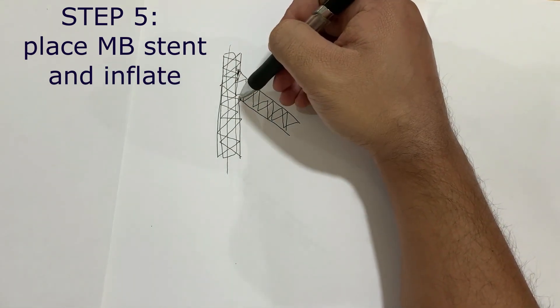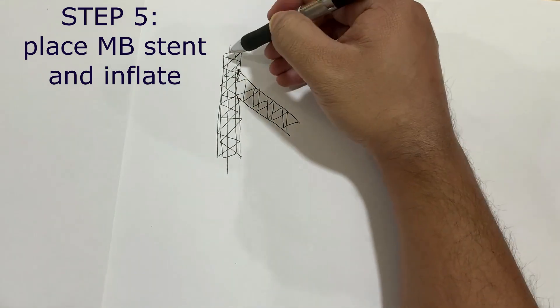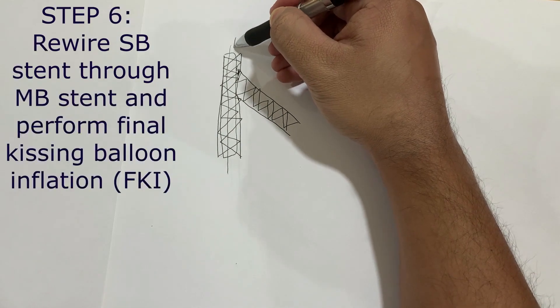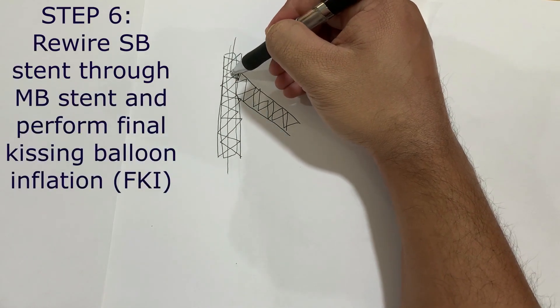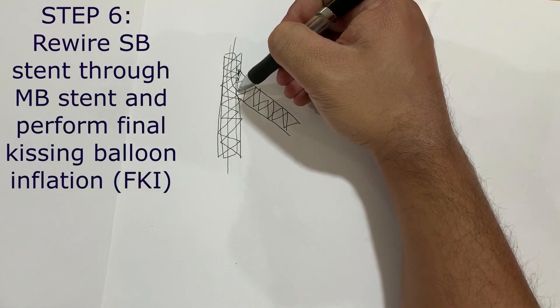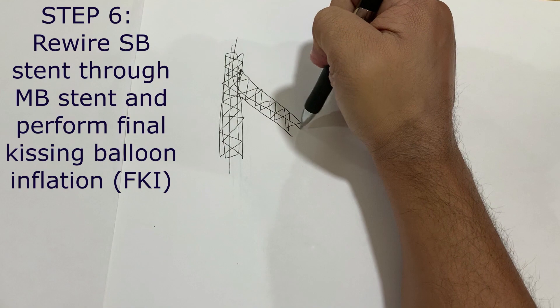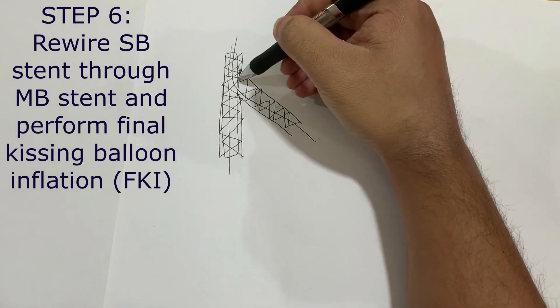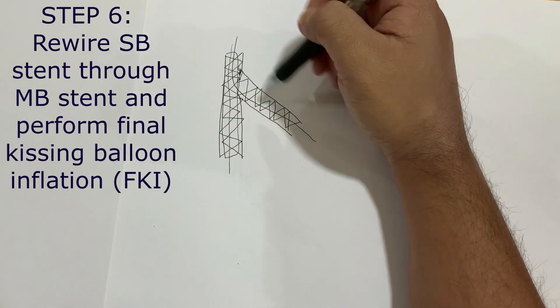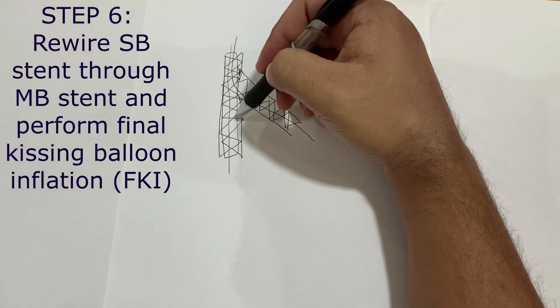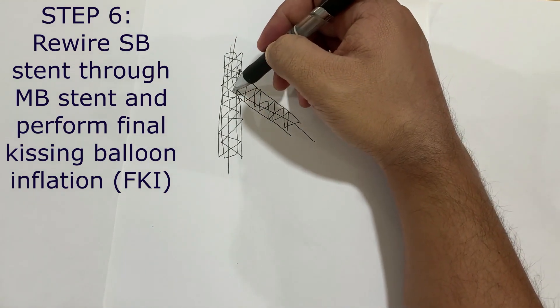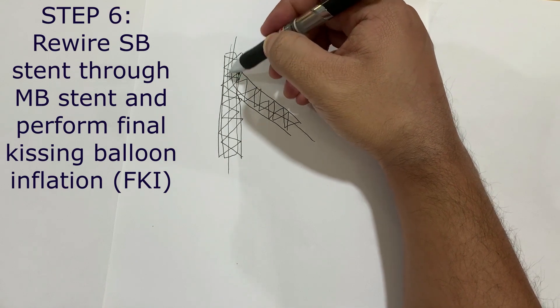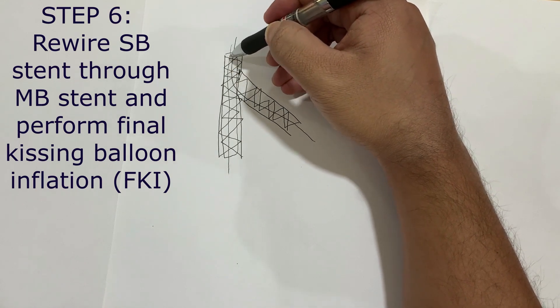Once this is inflated, this side will be crushed and there will be a carina that will be created. After this step, put a wire down through the distal strut. It's easier to get through the distal strut. Sometimes it's not visible but try to get through the distal strut.